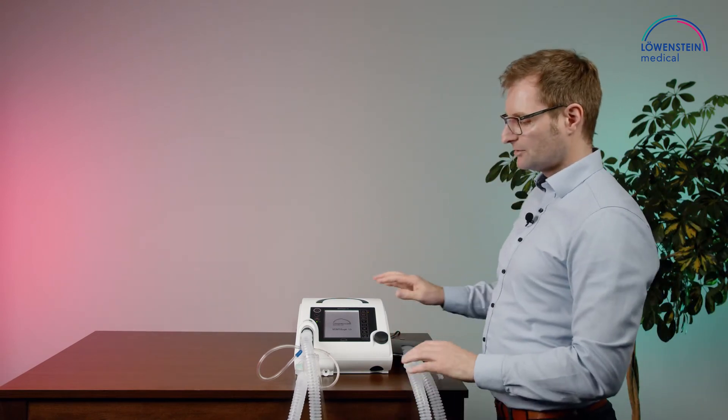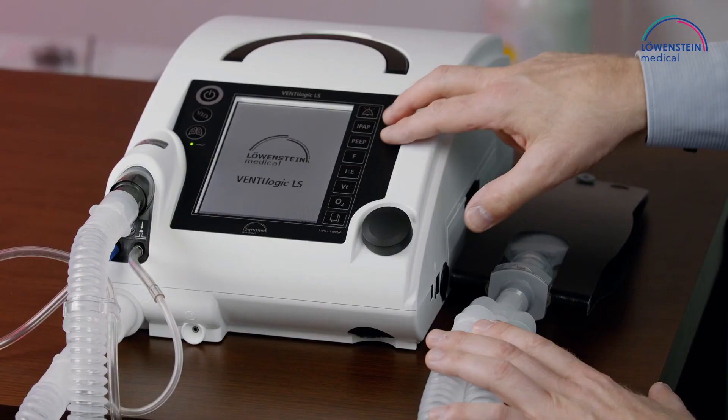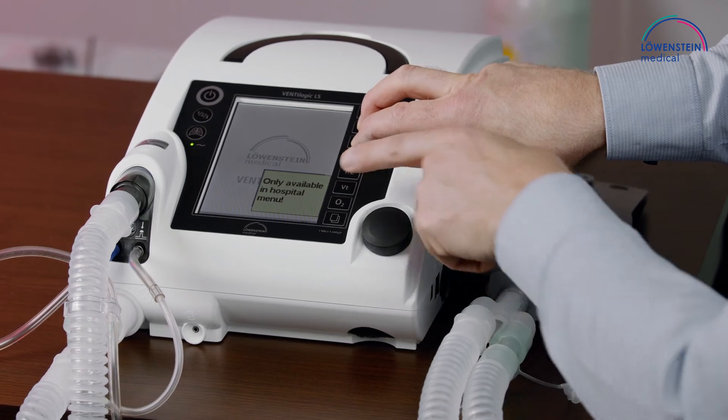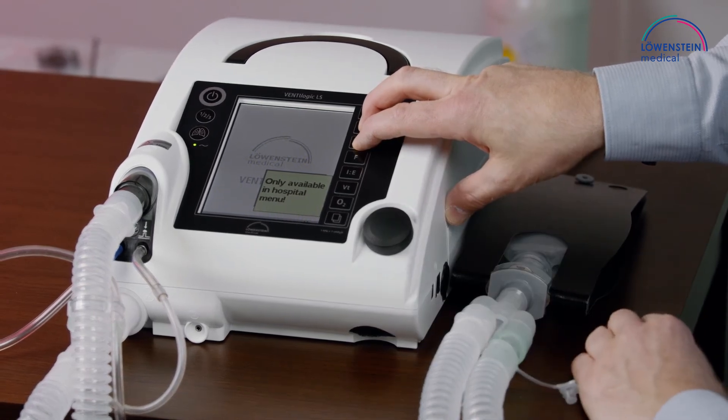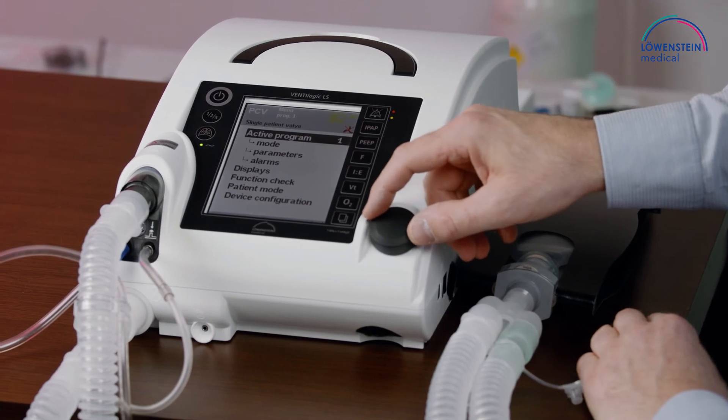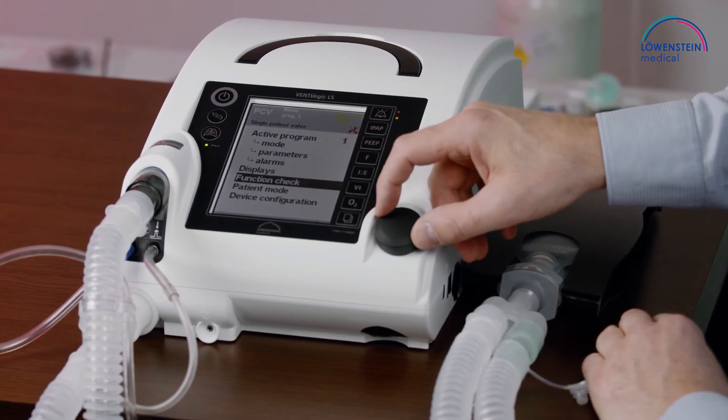Now we have to go into the menu. Unlock the device by pressing IPAP and PEEP simultaneously until the message is gone. Then enter the menu and select device configuration.